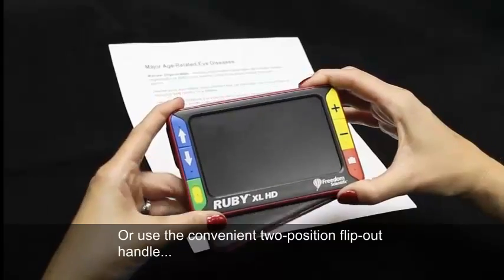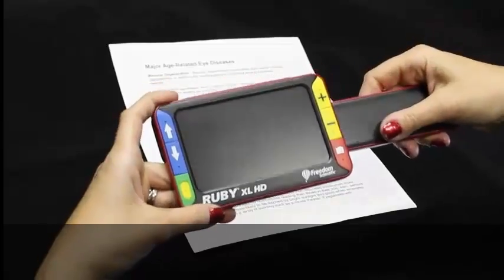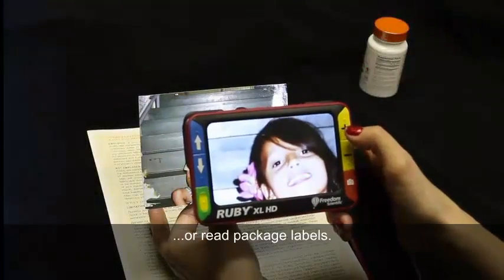Or use the convenient 2-position flip-out handle to view photos in true color or read package labels.